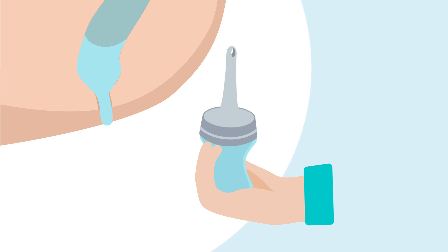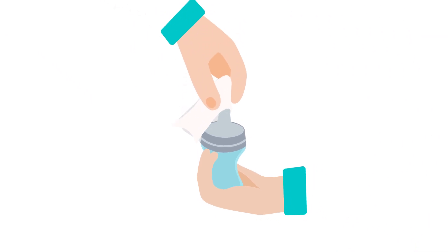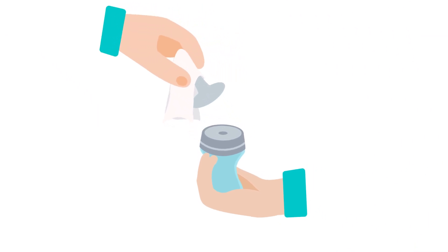To prevent soiling of the hand, the removal should be done in one movement. Hold the catheter with toilet paper or similar and pull to detach it from the water container.